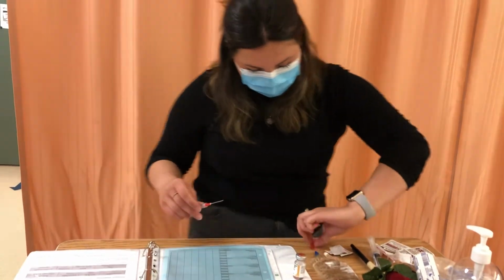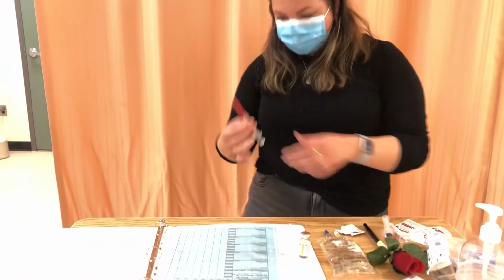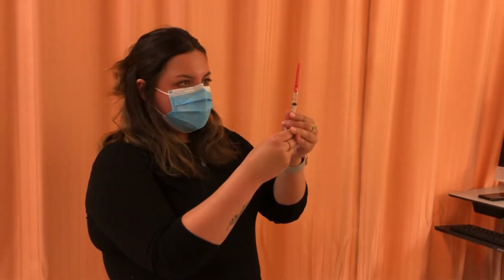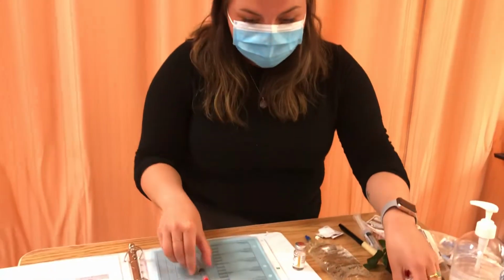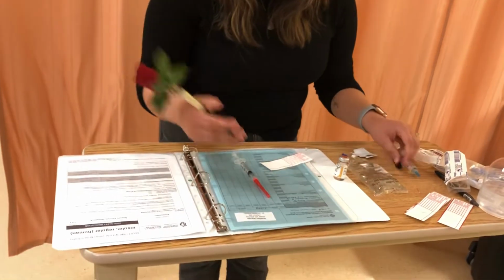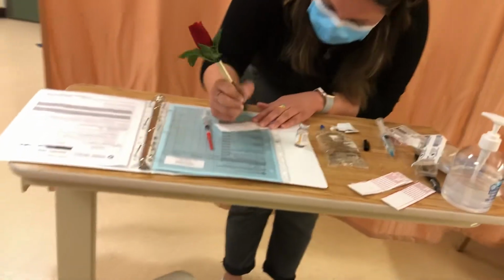Alright, so now my first check with my MAR, and then medications. So I need to ensure that I have 1 mL in here, and I will create a label for this. I want to ensure that I'm creating a label because this is a clear fluid and I could get it mixed up at any time.